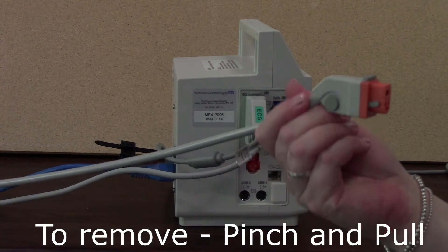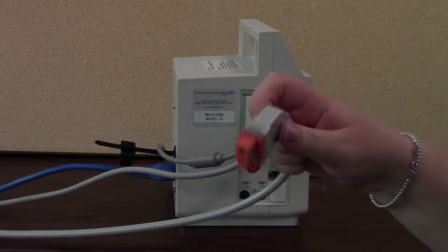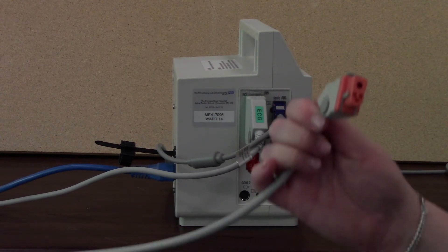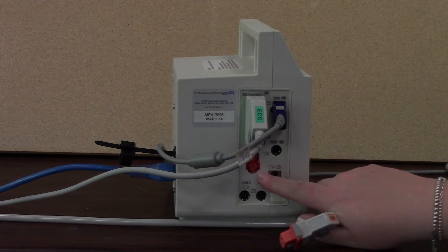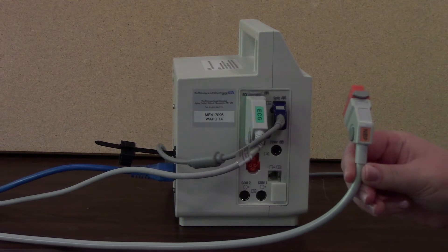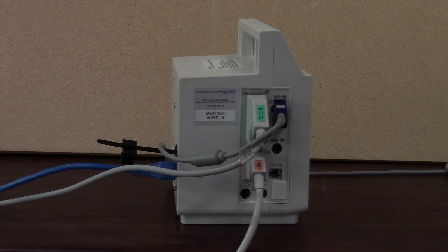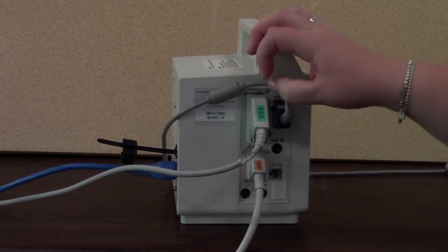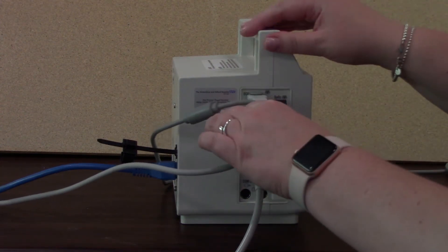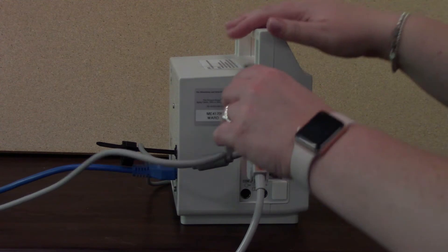You can see just at the side there, there are two little buttons — you pinch at the side and pull. The cables are all colour coded, so you can see that this one is orange and it goes into the orange blood pressure port. They're also labelled — you can see that says non-invasive blood pressure on it. To put it in, you literally just push it in. It's the same for the ECG — labelled ECG and colour coded as well, so just pull out and push in.